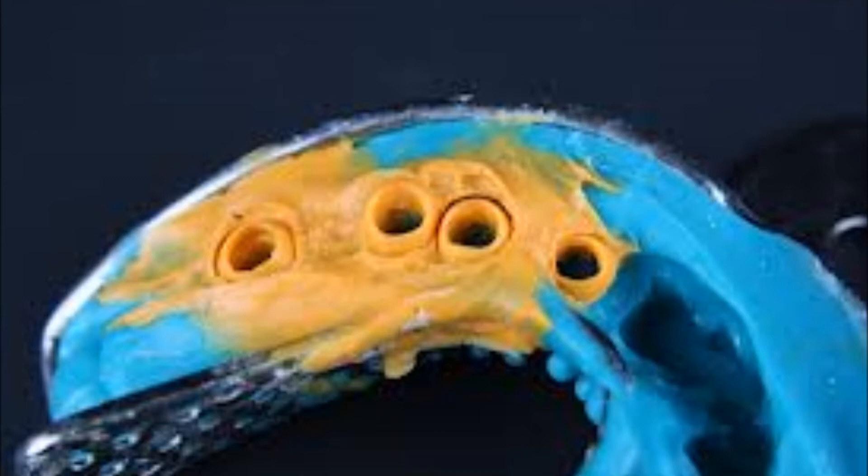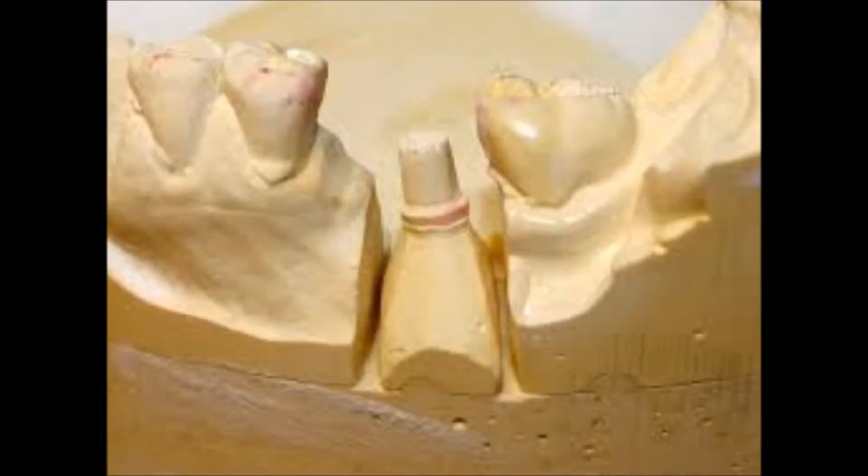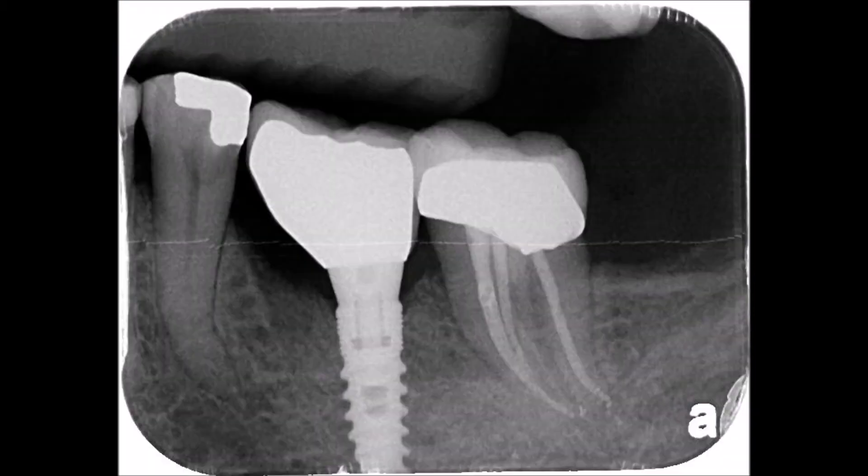Unlike the transfer impression, the G-Cuff impression allows the dentist to work with metallic trays. Metallic trays are rigid and can withstand any pressure inside and out. G-Cuff allows taking a precise impression without the need for transfers, eliminating analogs from the working model — obviously there is no need for splinting. Fabrication of a working model from an impression with G-Cuff is identical to that of natural teeth; there is no need to screw or snap in analogs. The model can be sectioned to create optimal working conditions for utmost restoration manufacturing.